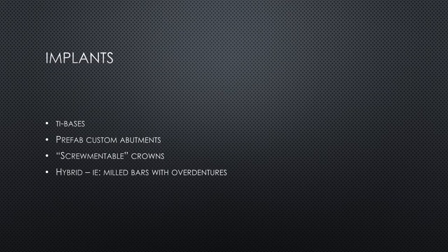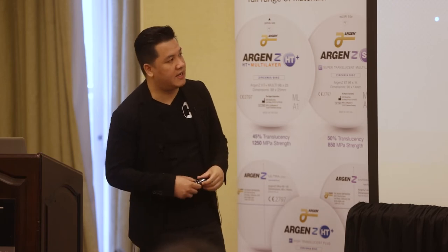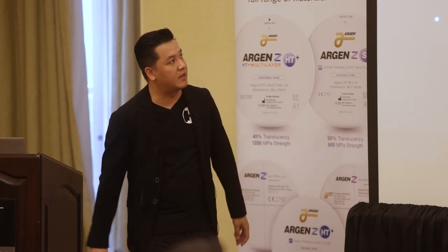With implants, you have Ti bases, which is really popular. You can do prefab custom abutments if you're able to mill titanium. The FDA is a little bit weird over here, but in the Wild West up in Canada, we're able to mill our own metal and everything like that. It's nice because you can. There are a lot of different options to really have great treatments for implants.